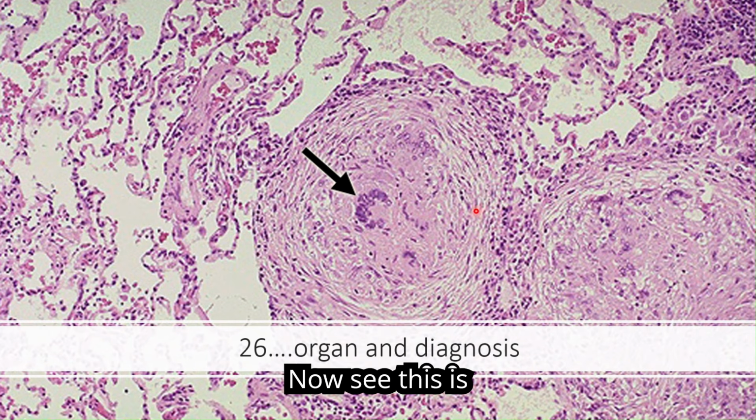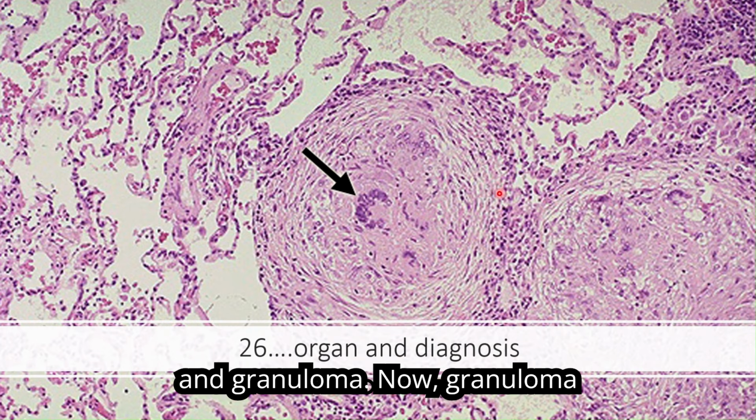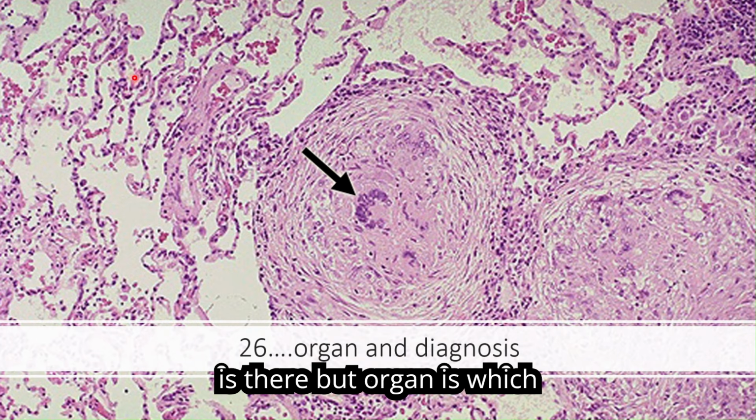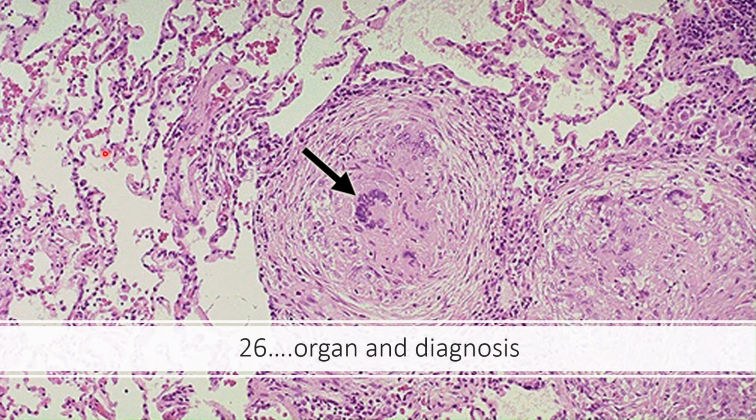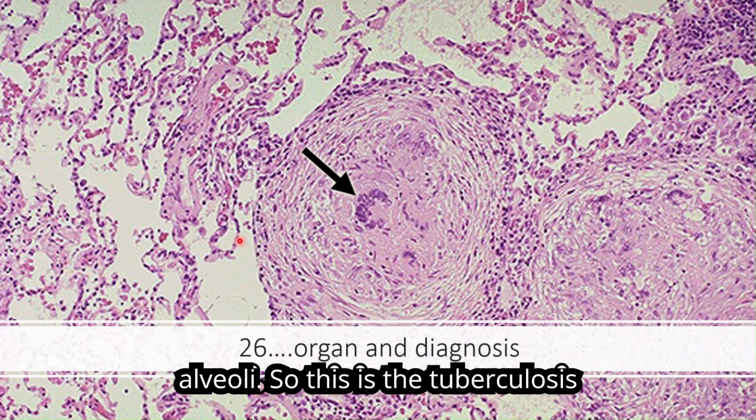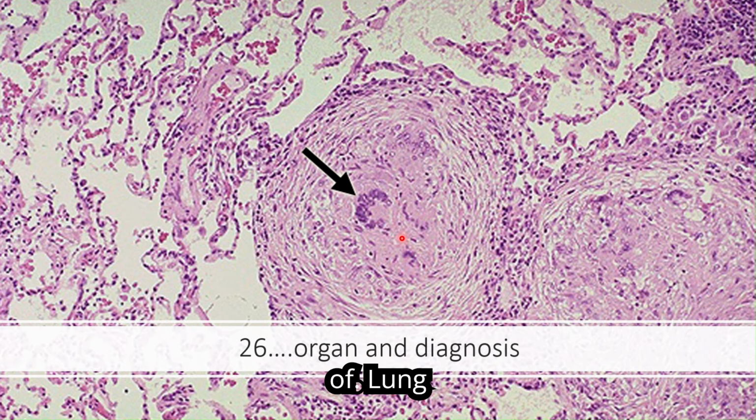Now see, this is giant cell, now you know, and granuloma. Now granuloma is there, but the organ you can identify here: alveoli. So this is the tuberculosis of lung.